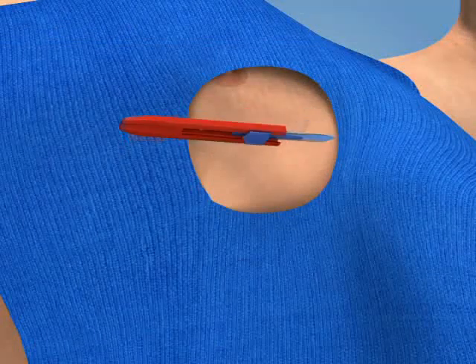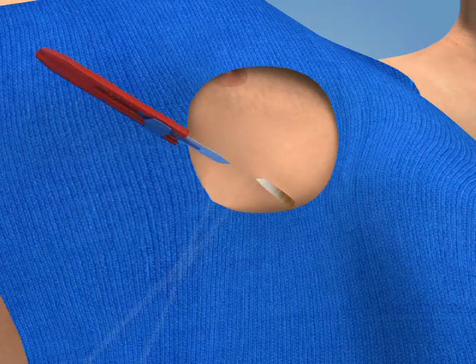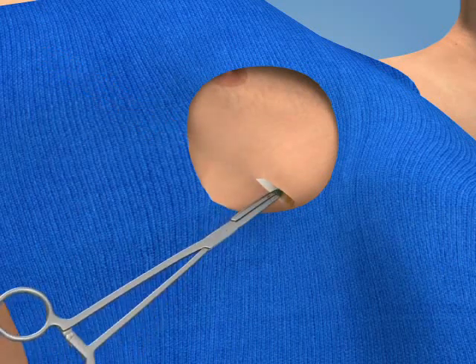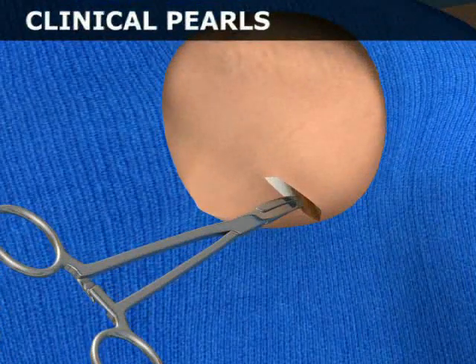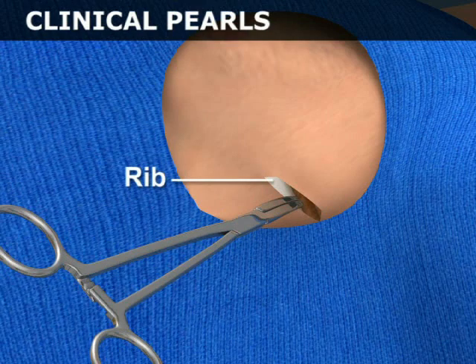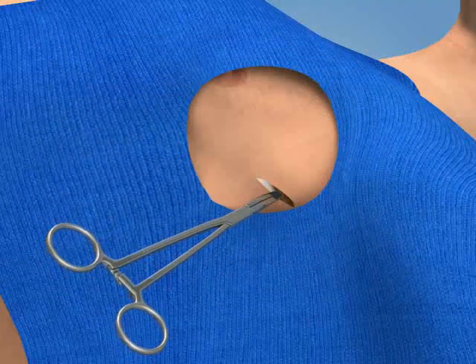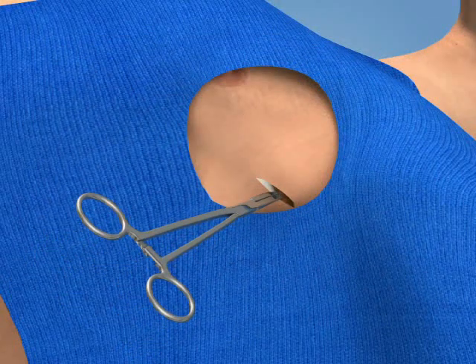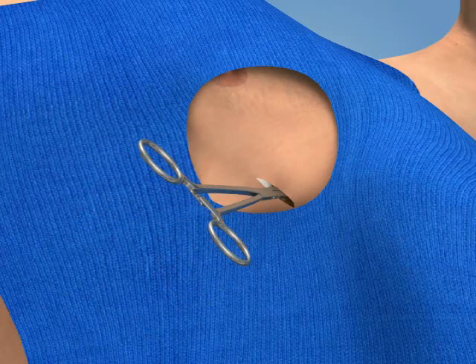Make a 3–4 cm skin incision with a scalpel directly over the selected rib. Use a Kelly clamp to bluntly dissect a tract over the rib. Create the tract immediately over the superior surface of the rib in order to avoid the intercostal vessels and nerve, which course along the inferior surface of the rib. You will encounter firm resistance when the parietal pleura is contacted.